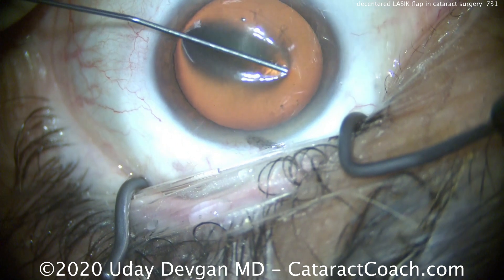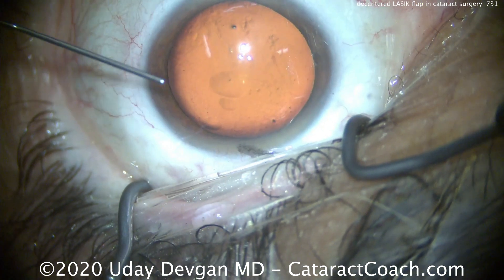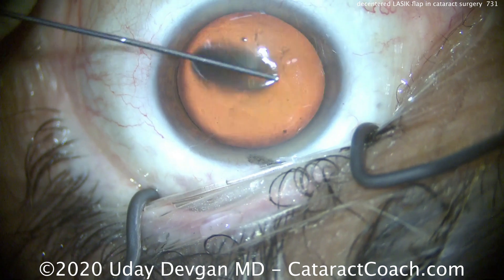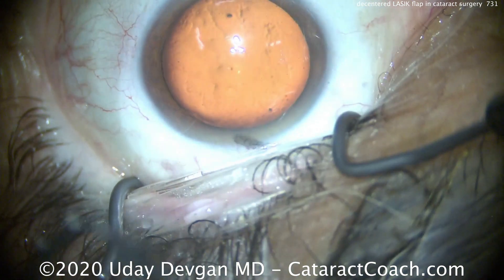And that will highlight the edge of the LASIK flap. You can see this LASIK flap is very de-centered. So we can no longer make our standard temporal phaco incision, because we don't want our phaco incision to intersect the LASIK flap. And this LASIK flap goes right close to the limbus, temporally.